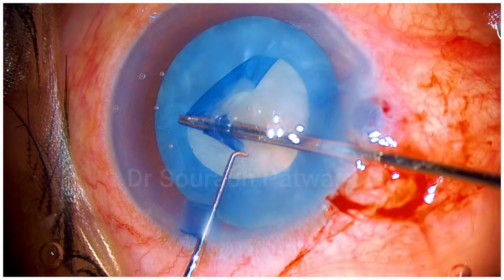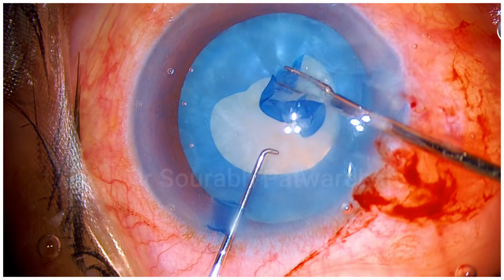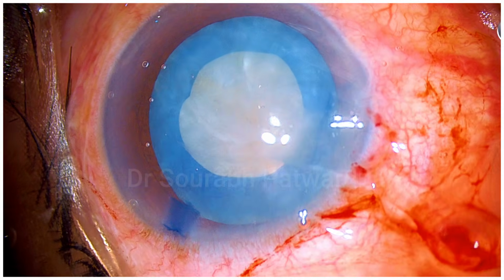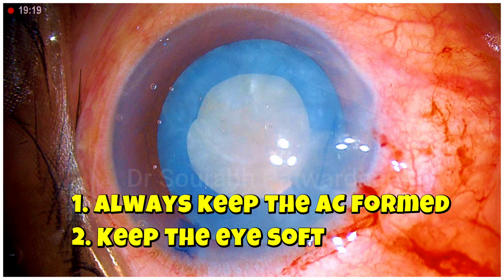Again, even at the end, you can see the final attempt is made so that the angle of that capsulorhexis edge is not outward, and so the surgeon is able to complete this rhexis without any problem. So apart from these two, of course, we have to always keep the anterior chamber formed and keep the eye a little softer side to have a very reproducible capsulorhexis in all our cases.